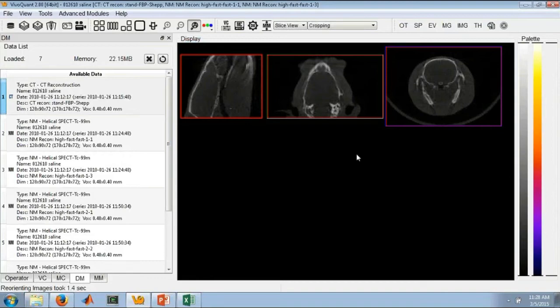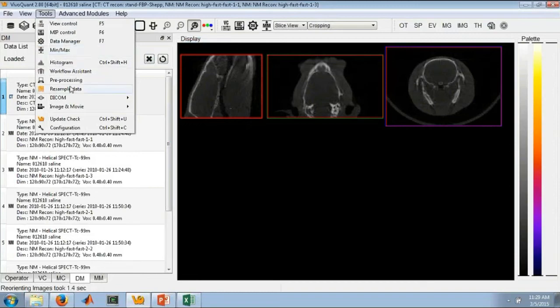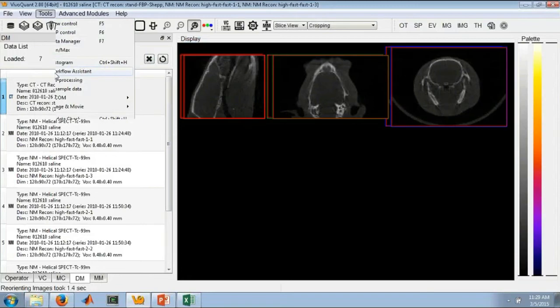This is particularly of interest to our clinical partners who would like to analyze the data in VivoQuant but also be able to view it simultaneously in an external DICOM viewer.